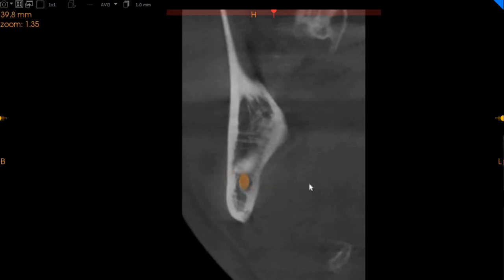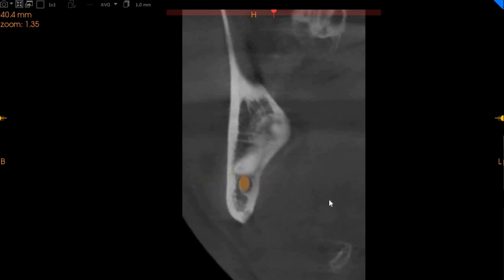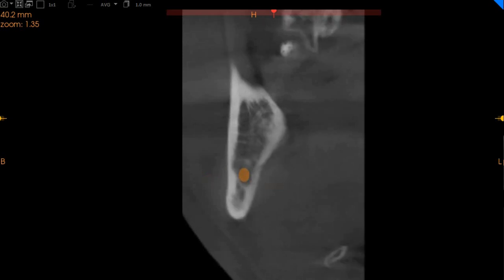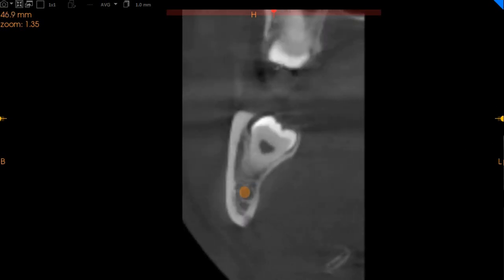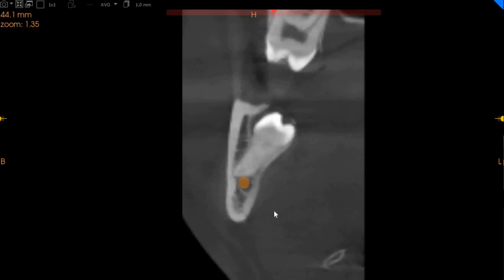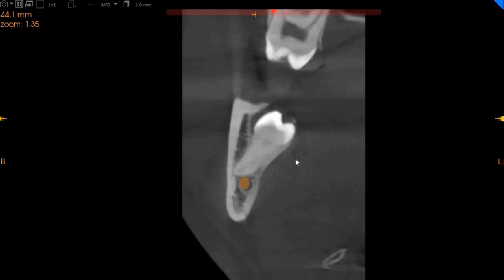So even though it's not enveloping the inferior alveolar nerve, the lower right wisdom tooth is significantly close to the inferior alveolar nerve. There is a risk for damage to the inferior alveolar nerve if this tooth is extracted because of the close approximation. The inferior alveolar nerve is inferior and lingual, and the tooth is buccally to the nerve.